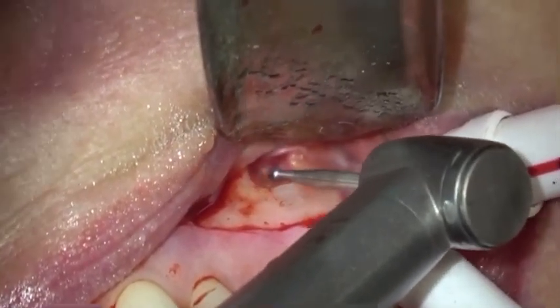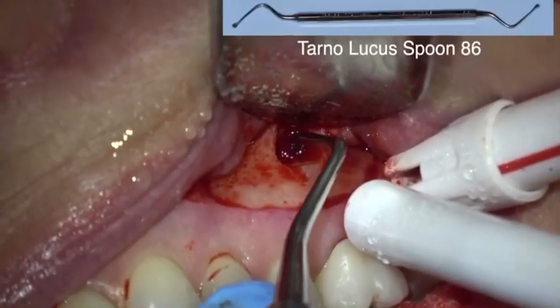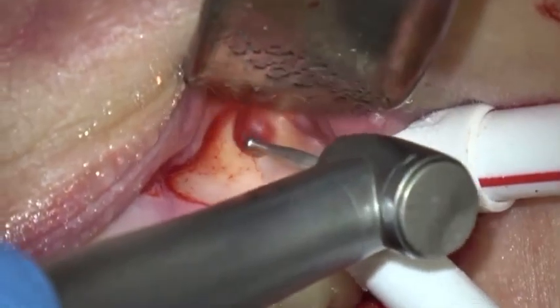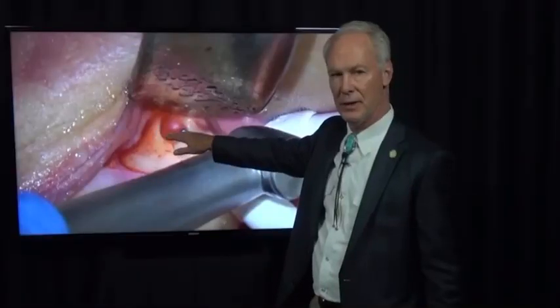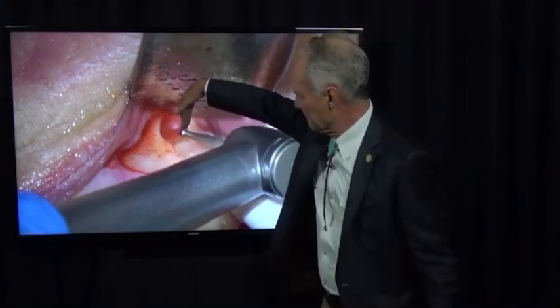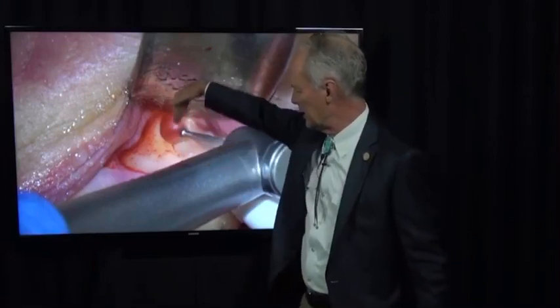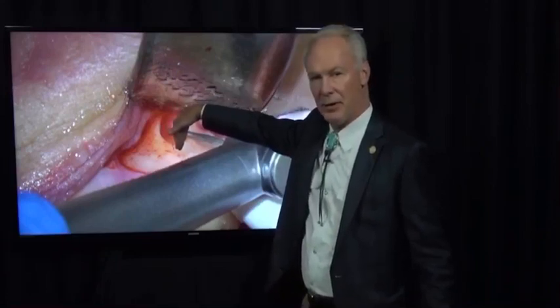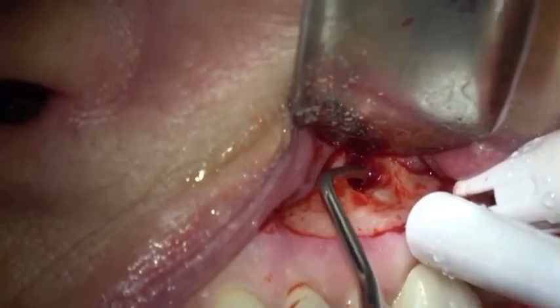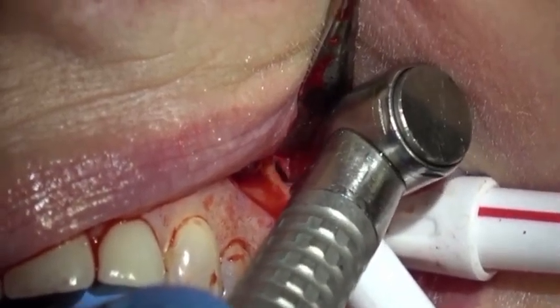You'll remember that root was just partially filled. I'm very lightly cutting the root of the tooth and now I'm curating any granulation tissue with this small spoon. When you make this cut — when you sever the root tip — you want to be sure the cut is angled like this, not perpendicular to the root, because you can't retrofill easily a root that's cut that way. You want the cut to be angled so you can retrofill it. You can see my angled cut right here.